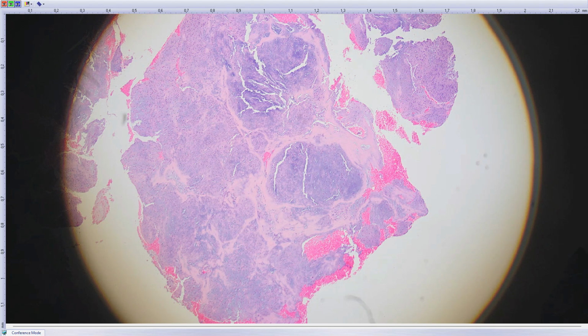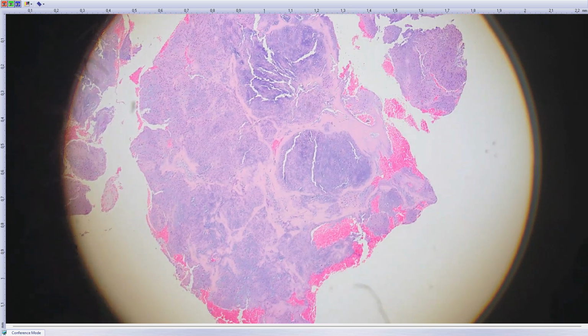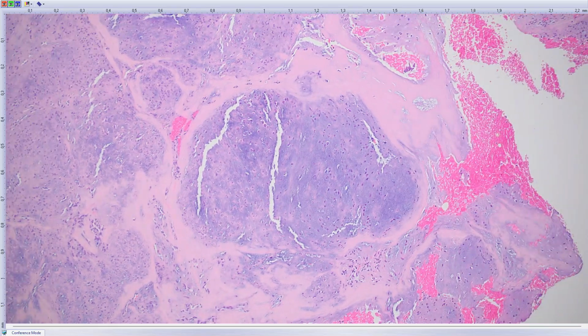And so how do you recognize this tumor? It's, again, a multinodular lesion, typically on the fingers or toes. It can be in the dermis. Most commonly, it's in the subcutis. Occasionally, it can also be in the bone. And the lobules are composed of this kind of chondroid matrix. Occasionally, you can see even mature hyaline cartilage areas, but in the minority of cases.